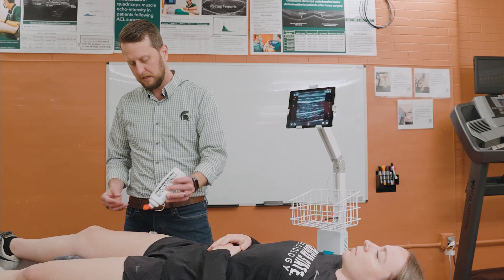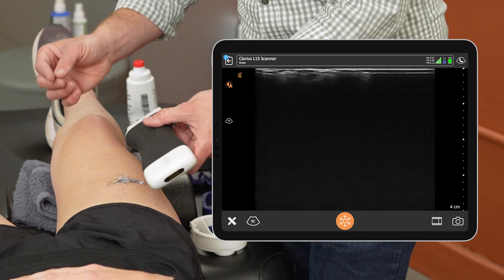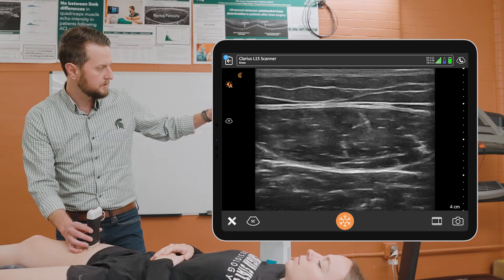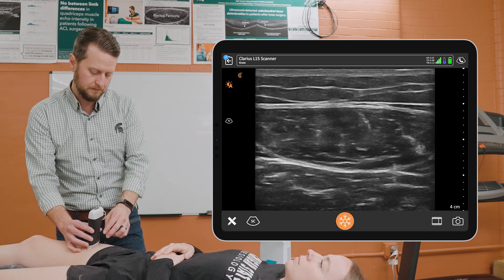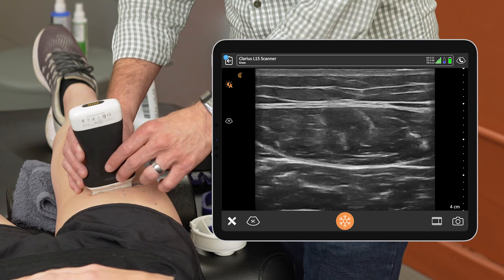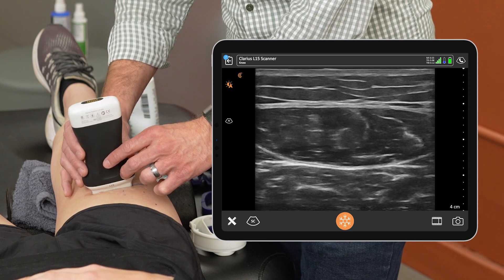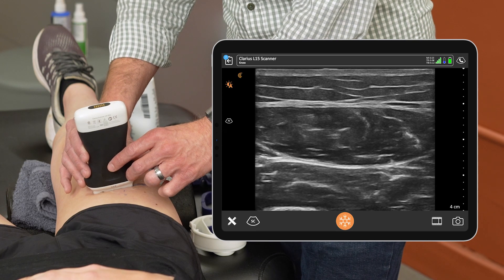Once we have that mark, I'll put some ultrasound gel down and use our Clarius ultrasound probe to identify the rectus femoris muscle. You can see in this image we have the skin, the underlying subcutaneous fat, as well as our rectus femoris muscle. Once we were able to visualize that muscle, we'll move the probe from medially to laterally just to see the full extent of that muscle and then find this central cross-sectional piece of this muscle.